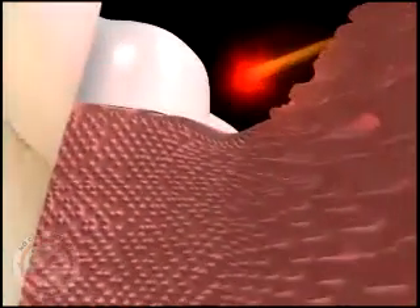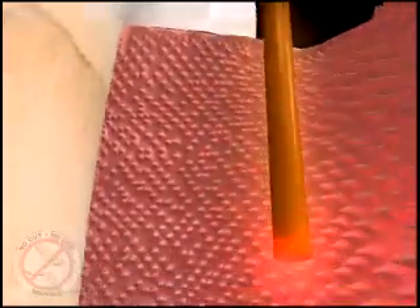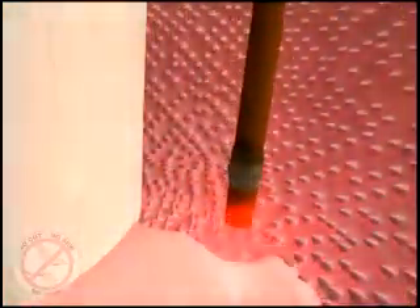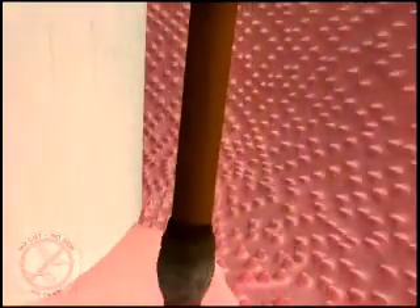Then the laser is used again at the bottom of the pocket to remove any remaining diseased tissue. This pass of the laser also sterilizes the tissue and bone and completely eliminates the bad bacteria, germs, and toxins.